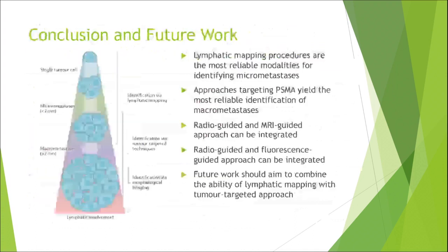So to conclude, lymphatic mapping techniques are the most reliable modalities for identifying micrometastases, while approaches targeting PSMA are most reliable for identifying macrometastases. As discussed before, integration between various techniques will lead to better outcomes, such as integrating ICG with 99m technetium nanocolloid, and the potential integration between radio guidance and magnetic guidance would lead to more accurate results for both preoperative and intraoperative imaging.